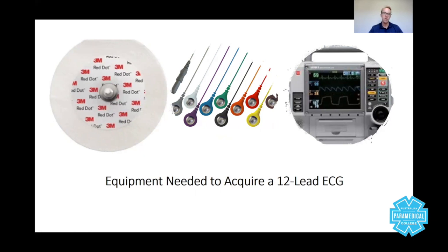But imagine doing a 12 lead on a female. Of course, it makes complete sense that you would put the gloves on to help the female patient feel much more relaxed. Now, on the backside of the electrode is a sticky gel. And the role of the electrode is to collect the electrical signal, which will then be sent down the wires and interpreted using a complex set of algorithms into the ECG.